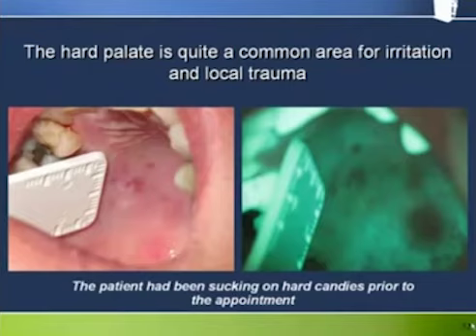Mystery solved. If this same presentation had occurred in a 50-year-old patient with a history of drinking and smoking and with no other obvious acute cause, we might have approached it differently. We've always got to remember that the presentation under the VELscope is only part of the picture. It must always be contextualized within the larger clinical picture. Similarly, the white light presentation is also only part of the picture. Palpation is another critically important part of the oral examination process, as is the acquisition of a proper medical history with identification of relevant risk factors.